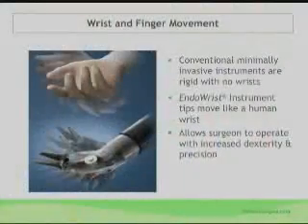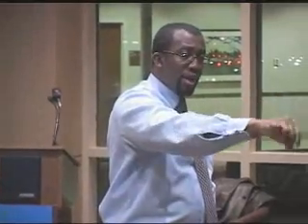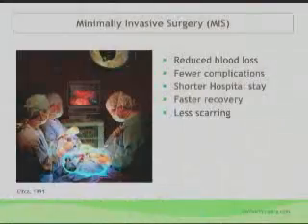Okay, that's what traditional laparoscopy is for us. It's instruments that can reach forward and move side to side and stuff like this, but they're fixed. Da Vinci is the idea of now I have something that can reach and turn and do like this, and that's the ability I have available to me. A wristed motion sets this light years away from what we're used to under traditional laparoscopy.